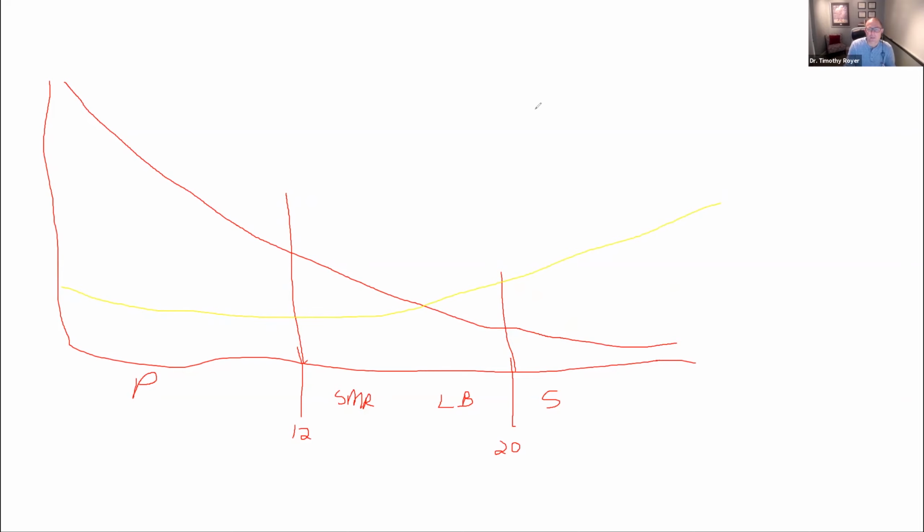First of all, I would know that we have got way too much extra current here, and there's something going on in an anxiety response.